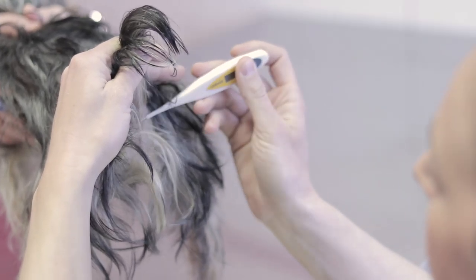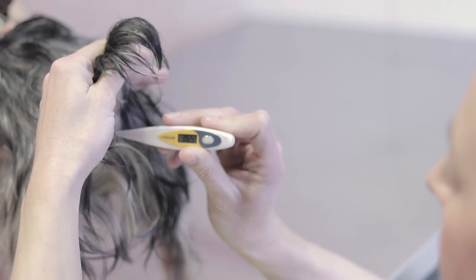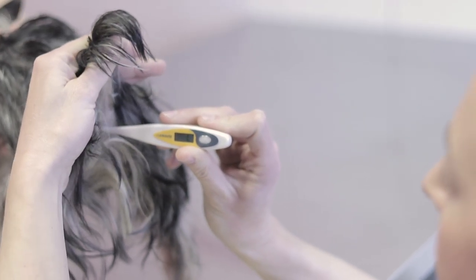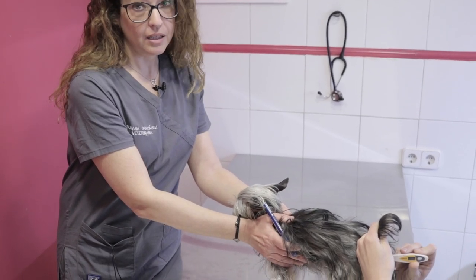Before insertion, we need to raise the dog's tail for easier access. We insert the tip of the thermometer and move it to the side as indicated. We then have to wait a few moments until the thermometer gives us a reading and the temperature appears on the screen.